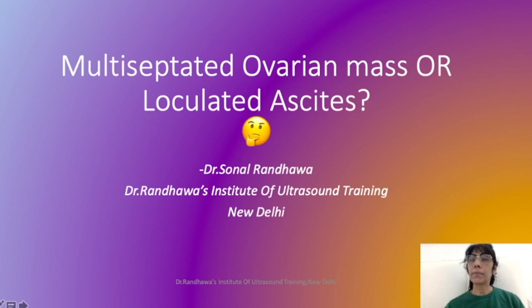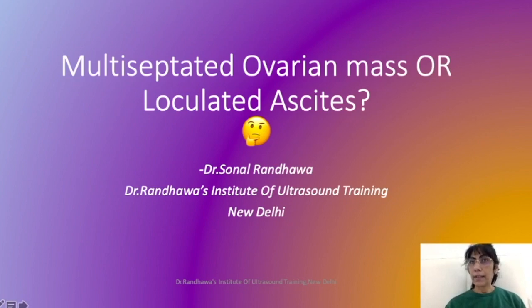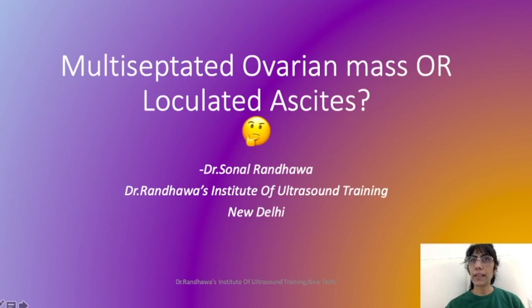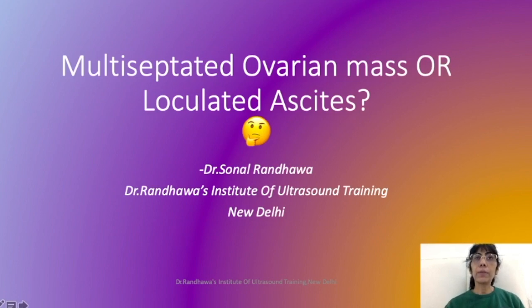I'll tell you one basic point that will help you know whether this is a multiseptated mass or loculated ascites. A mass is a space-occupying area, so when there is a space-occupying area, what happens to the surrounding bowel loops and organs? They will be pushed aside. As a result, when you see a multiseptated mass, you will not see any organ entrapped within it or bowel loops floating within it — everything would be on the sides. It would be a clear mass.